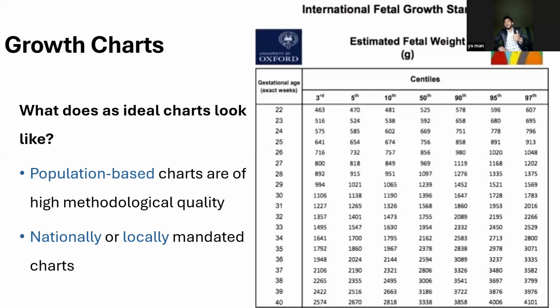The reason behind this is the INTERGROWTH-21st Century growth chart. The reason that I use this chart is that in its methodology, it accounts for nearby regions like Kenya and South Sudan. So those individuals have similar growth potential like our country and nearby countries, the same weather, the same population.